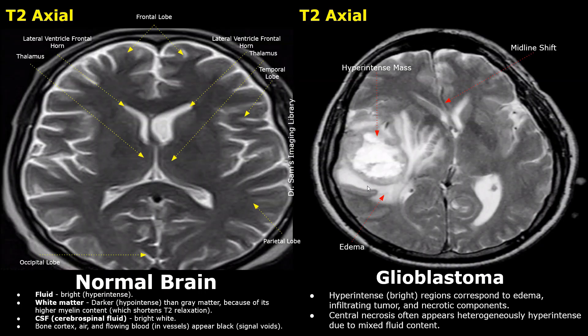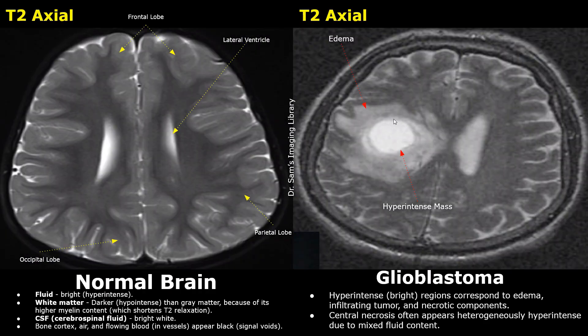This is another T2 image showing a glioblastoma. The mass is hyper-intense and it is surrounded by edematous regions. This is vasogenic edema. Vasogenic edema is the accumulation of fluid and proteins in the brain's extracellular space caused by a breakdown of the blood-brain barrier.